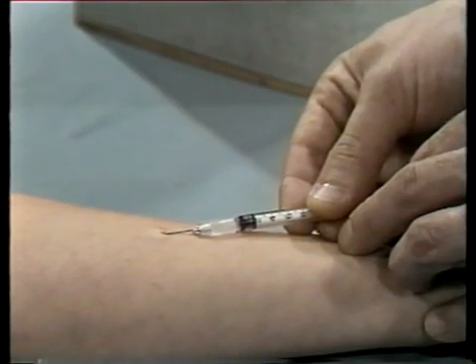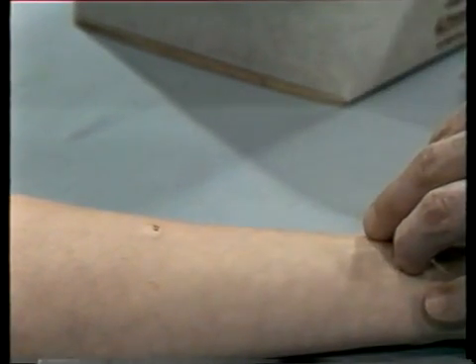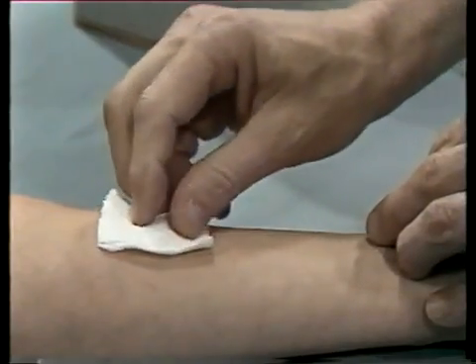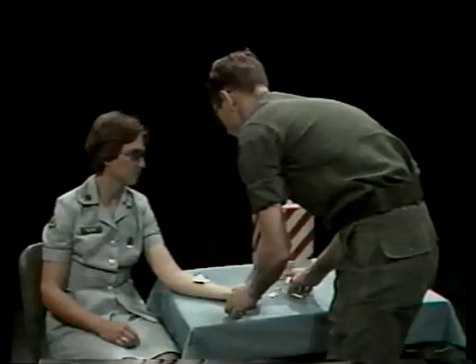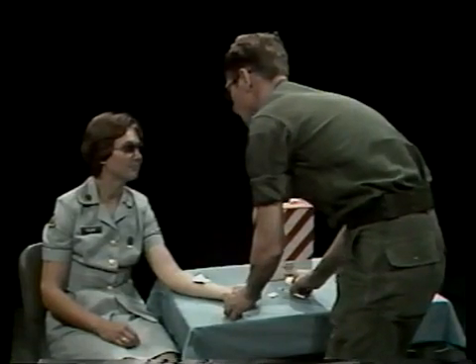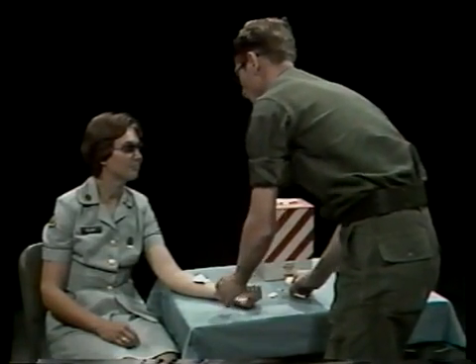Withdraw the needle and blot the site with a dry, sterile sponge. Don't massage the circular bump, and caution your patient not to rub or scratch it. You don't want to disperse any of the solution into the underlying tissues.